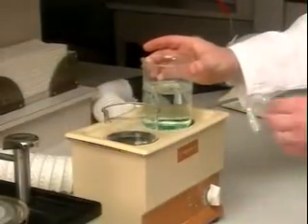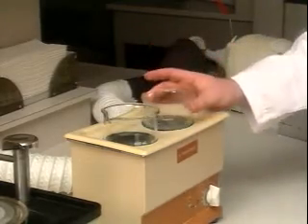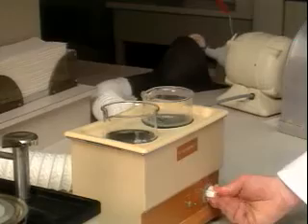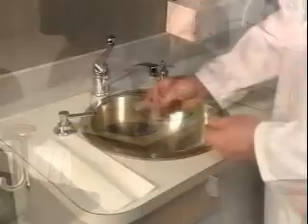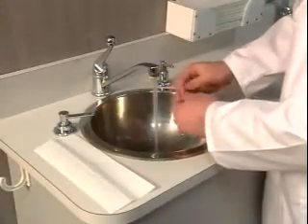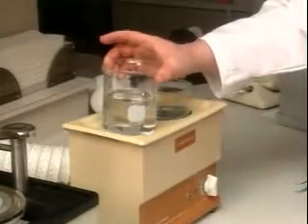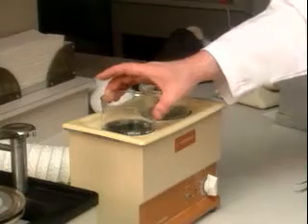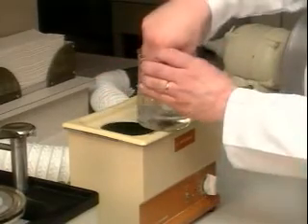Place the transfer trays in the ultrasonic beaker with a 10:1 ratio of water to dishwashing detergent. Remove the trays after cleaning. Rinse the trays with tap water. Trays are placed back in the ultrasonic for final cleaning in distilled water only. Remove from the beaker. Air dry the tray.